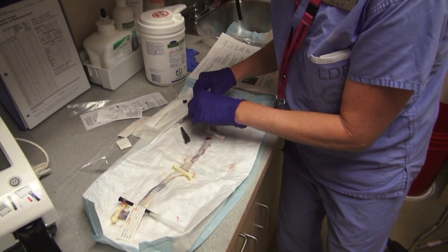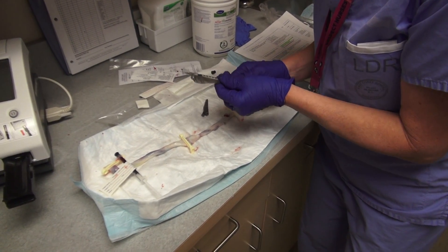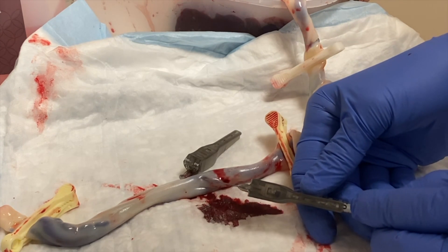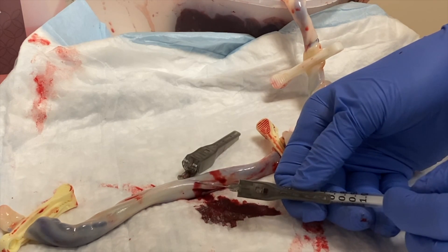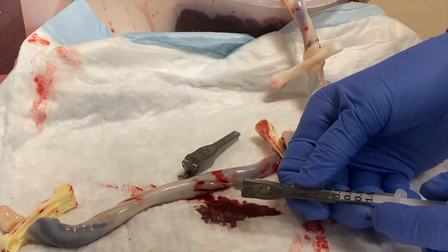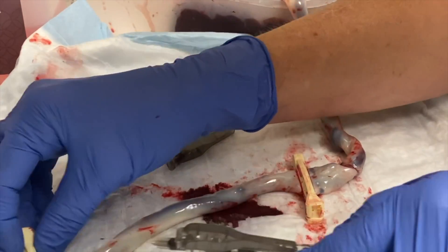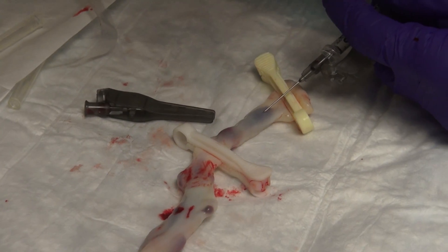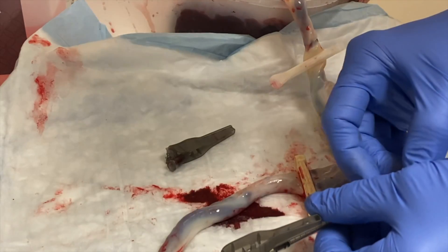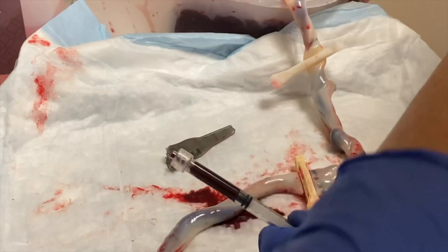Now I'm going for my arterial sample. Again, make sure there's no air, bevel is down. I'm going to try to get into that umbilical artery, which is a little bit smaller and can be a little bit trickier. I'm just getting a little splash here right now, so I'm going to try in another spot because that one is just not going to provide what I need. I've got another artery right here. Let's see if I can get a bit more blood — there we go, I'm getting a bit more. Push it off so I have just blood in there, and cap it.